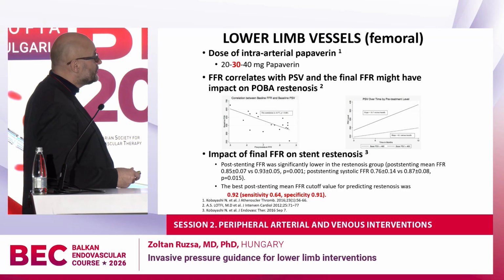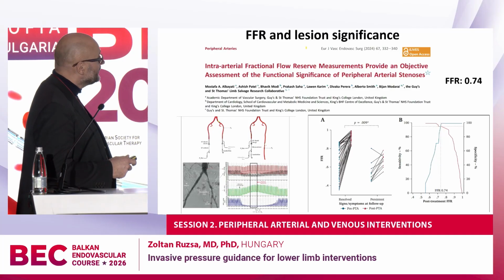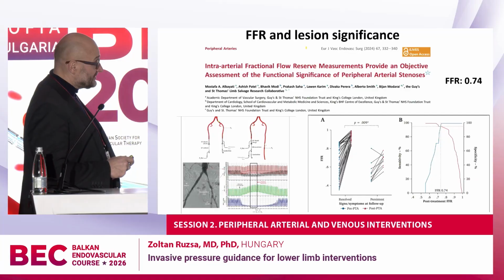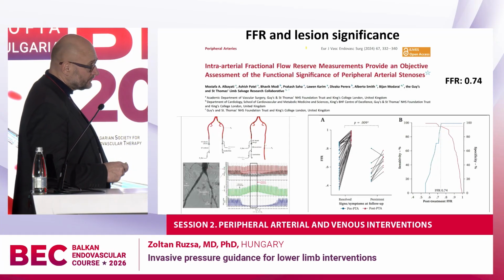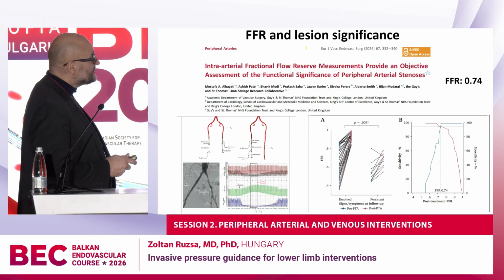So it's very good not just for intervention but also for assessing the final result.